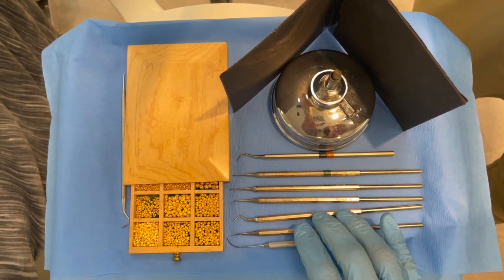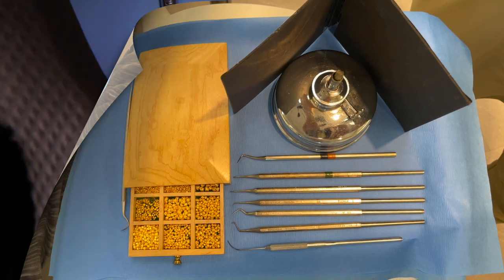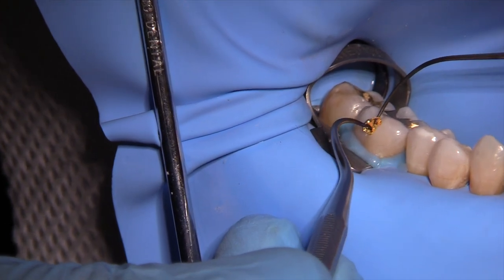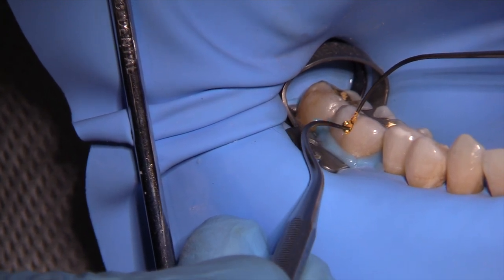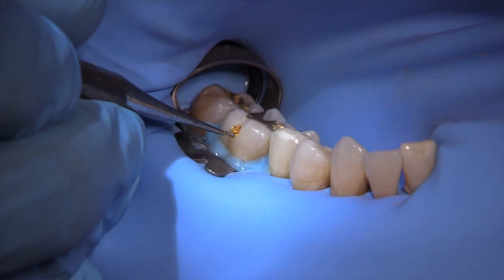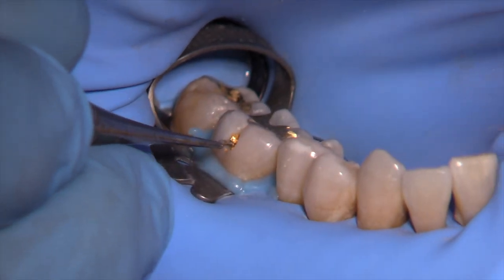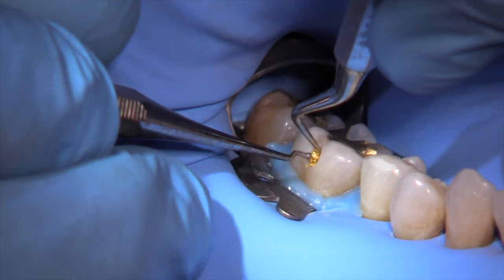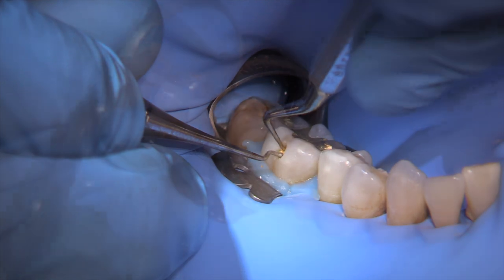Easy gold needs to be heated differently than gold foil — we need to burn off the wax used to hold the powdered gold together, so it gets flamed a little longer. Then we place this as the initial increment and condense it somewhat like amalgam, pushing into the walls with force to get into the retentive features. It flows nicely and creates good filling volume. Notice that I'm bracing the foil with another condenser while packing it into the cavity.